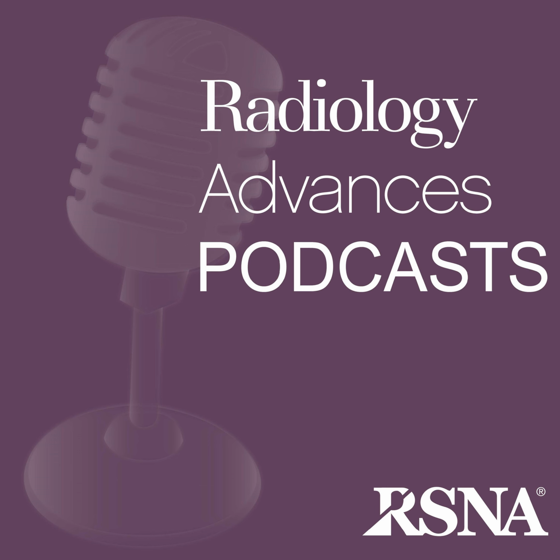So we have a better image. But the problem of subjective interpretation remains. Why do we need this other piece, the GCNR? Why not just have the radiologist look at the better SLSC image? Because even with a better image, the human eye is still subjective. Quantification is what drives standardization. The GCNR is an objective number, a ratio that you apply to that SLSC image.